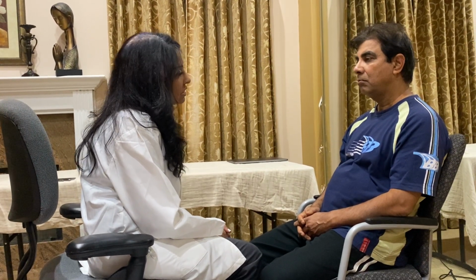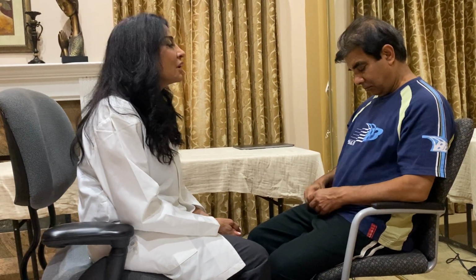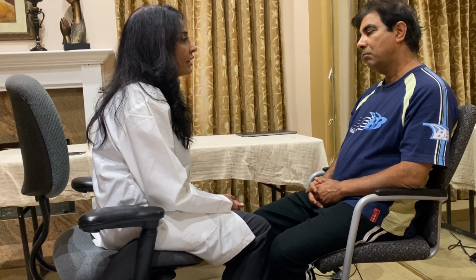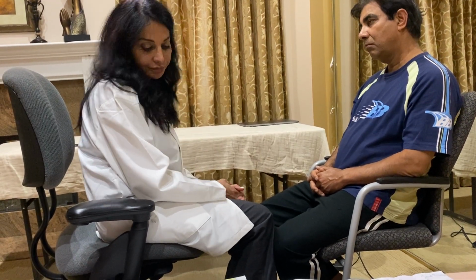The ear canal was a little bit narrow, probably secondary to the swelling. There is some redness there, and the patient did have some pain, but the eardrum is definitely gray and pearly. I do not see any infection or sign of infection there. The drainage was only slight and clear.